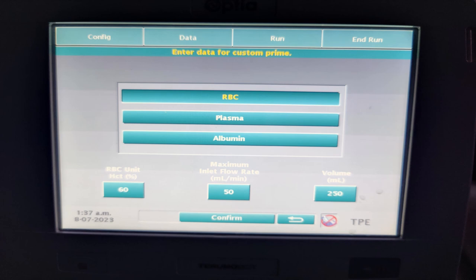In this case, we will be using RBC. The hematocrit of the unit is given as 60. The flow rate that we set is around 50 ml per minute. The volume of 250 ml is taken from the PRC unit, which will have the volume mentioned on it.